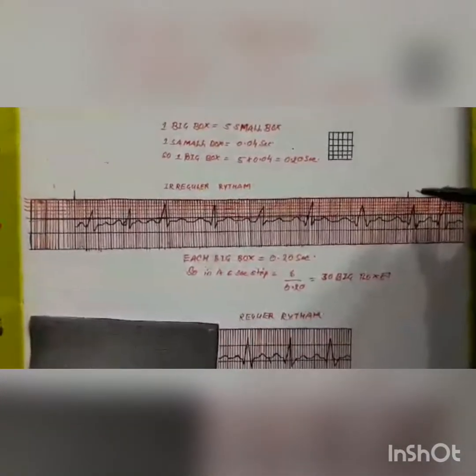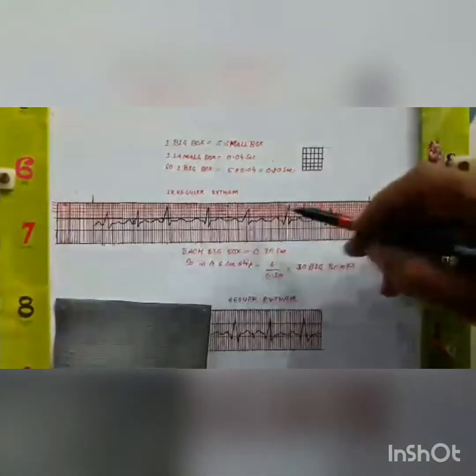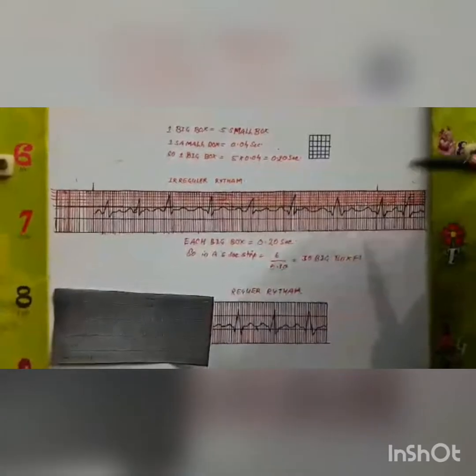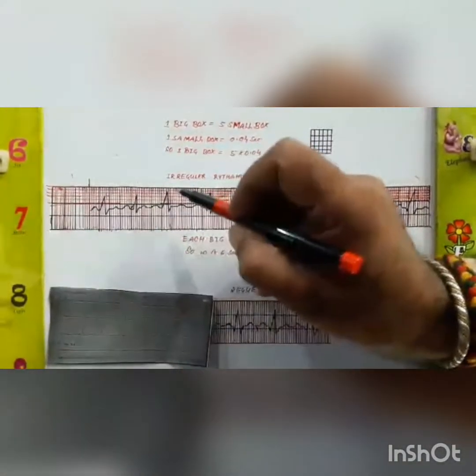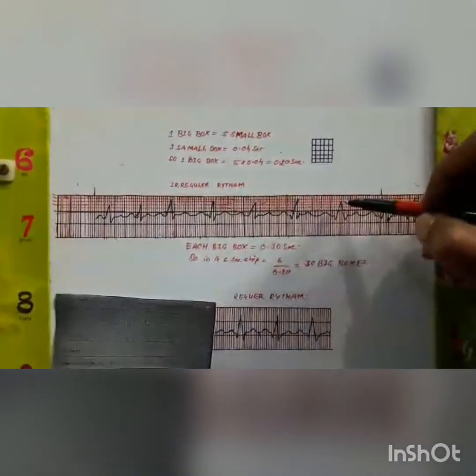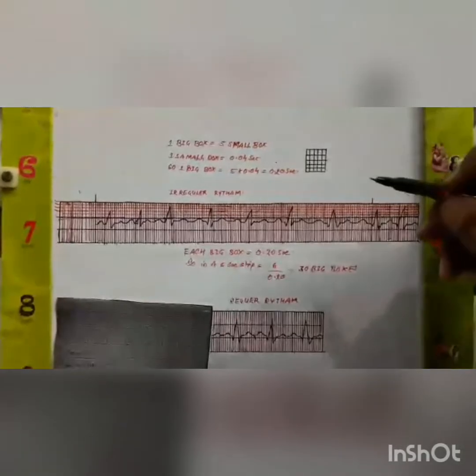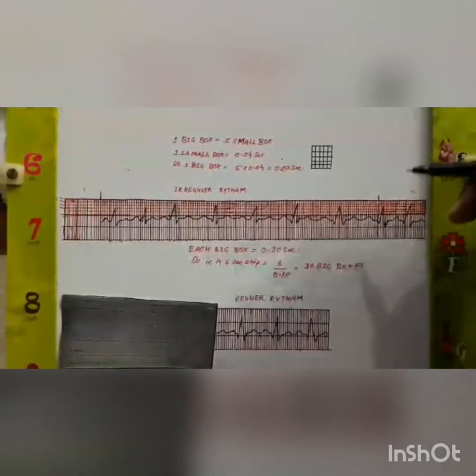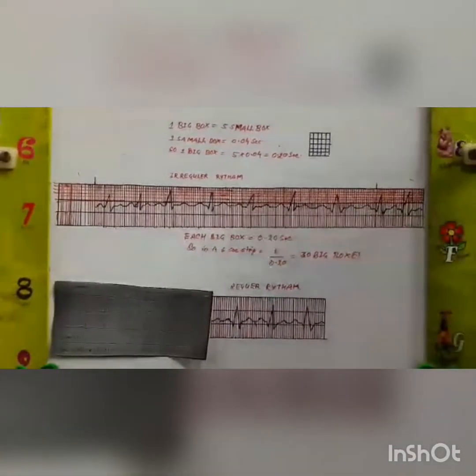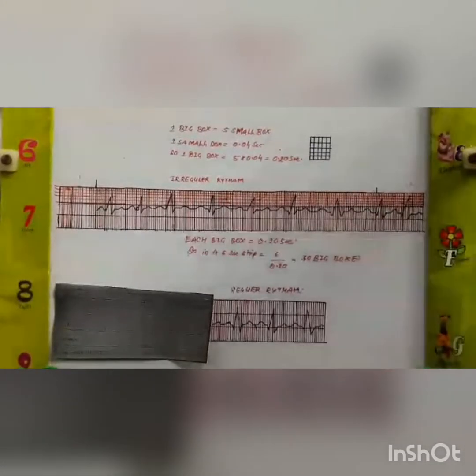Step five: the heart rate. For estimating the heart rate, we first need to know whether the rhythm is regular or irregular, because the formula is different for each. In case of a regular rhythm, we count the number of big boxes between two R waves. In this diagram, there are three big boxes between two R waves, so we divide 300 by 3 — the heart rate is 100. So the magic number is 300: divide 300 by the number of big boxes between two R waves.